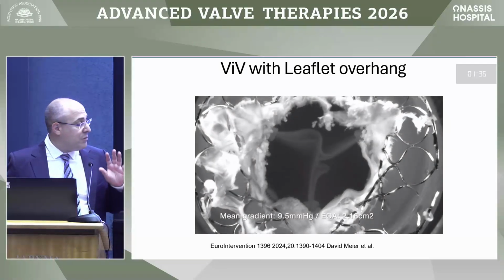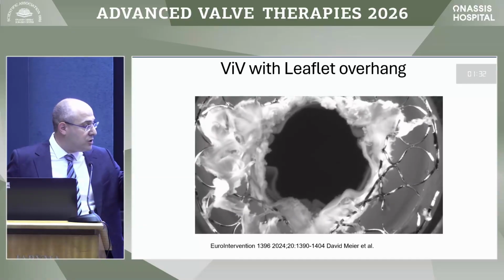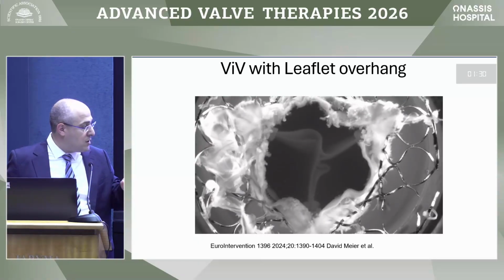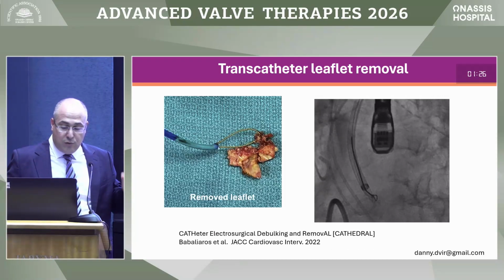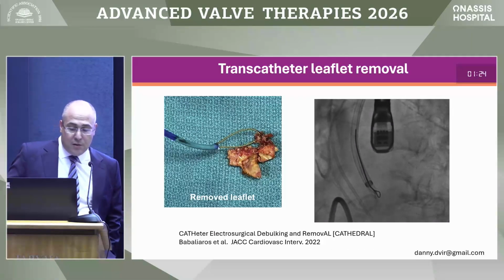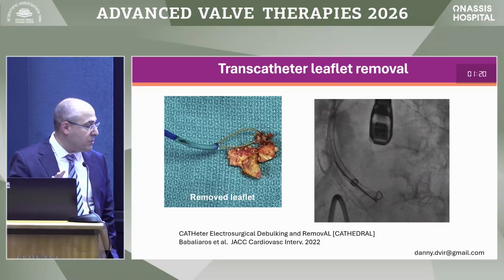But we need to respect the option of doing leaflet overhang, low implantation of a short TAVI device inside a long device in order to allow for some overhang. There are methods to do leaflet removal in the cath lab.